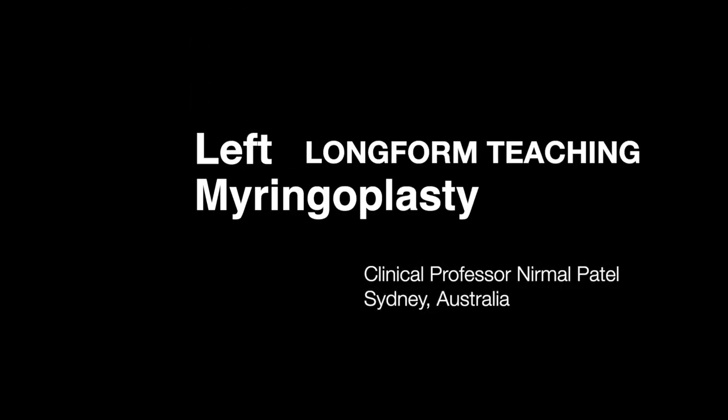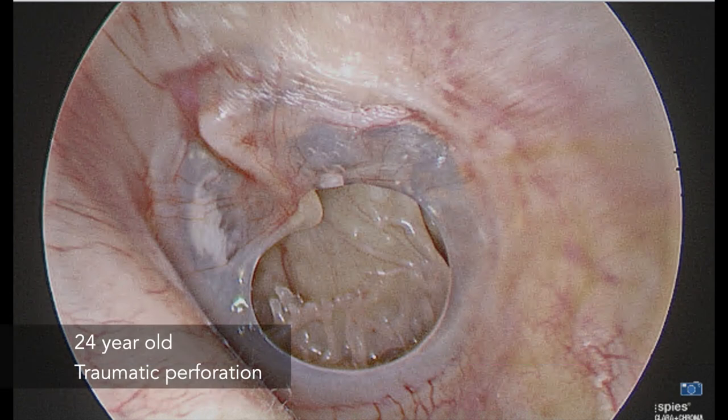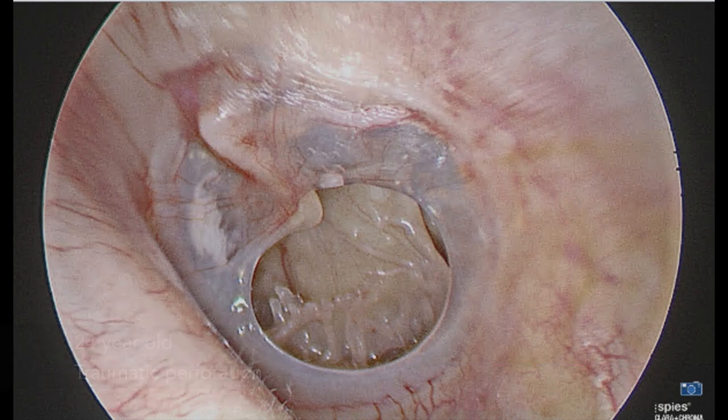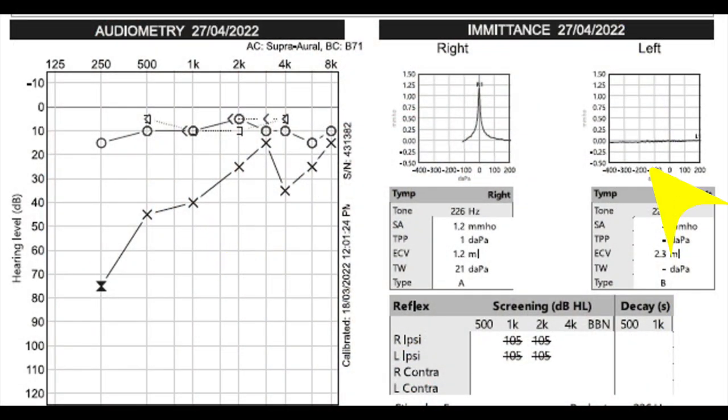Welcome to this long form teaching video for a left cartilage myringoplasty, presented as an endoscopic and microscopic case. This 24-year-old patient had a traumatic tympanic membrane perforation with some anterosuperior tympanosclerosis, and on preoperative audiometry there was a conductive hearing loss noted as well as a type B tympanogram.